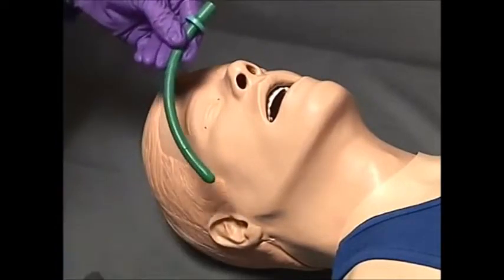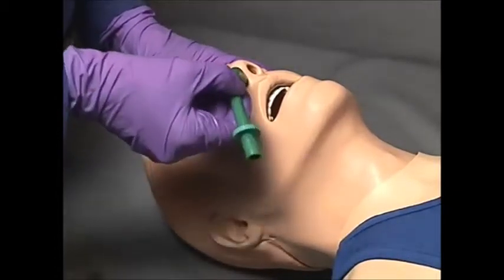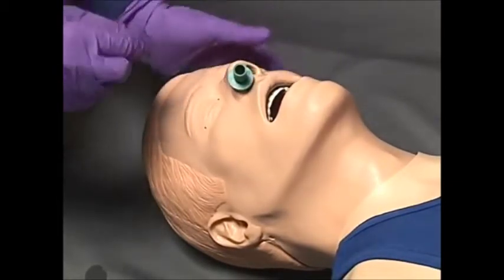If inserting the nasal airway into the patient's right nare, insert so as to follow the normal anatomical curvature of the nasopharynx with the bevel toward the septum. Direct the nasal airway along the floor of the nose into the oropharynx.